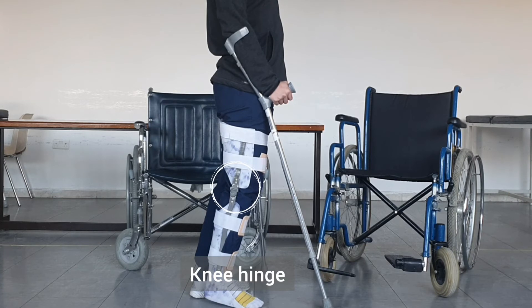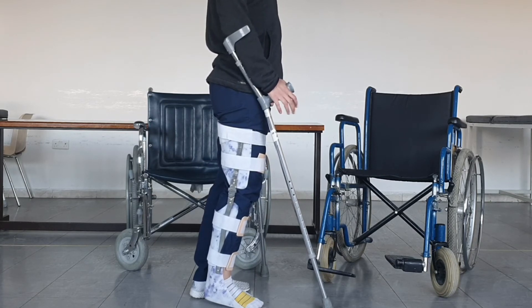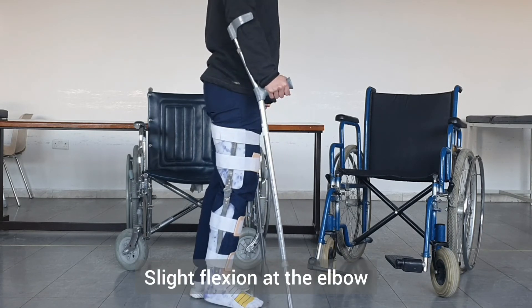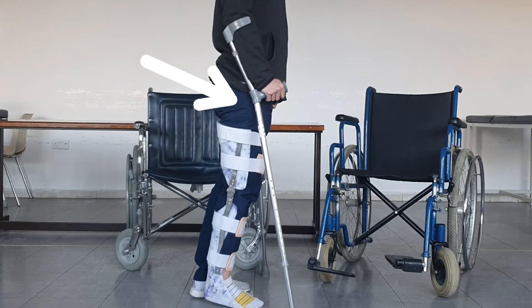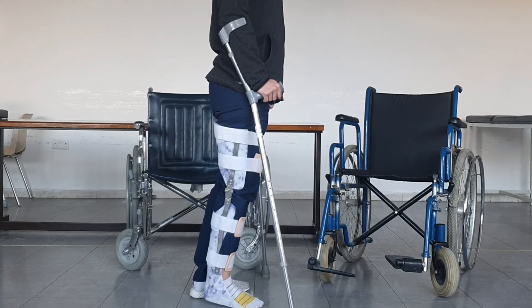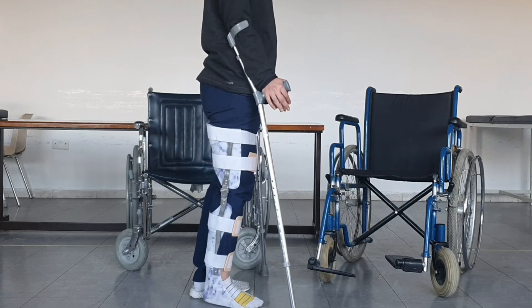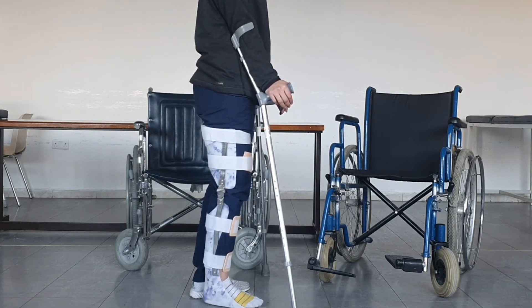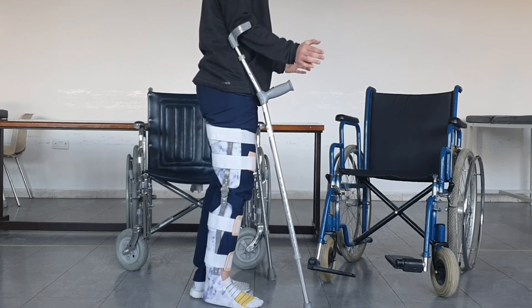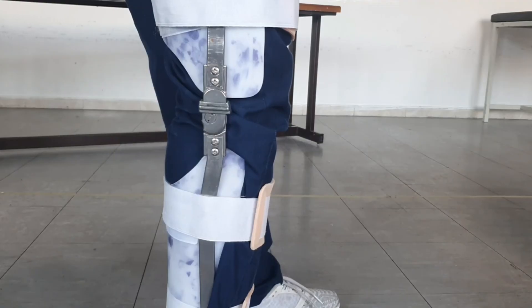The elbow crutches are adjusted so that when the patient is holding the handle there is slight flexion at the elbow, and it is at the level of the greater trochanter — just like fitting any crutch — and the elbow piece is slightly below the elbow. The advantage of elbow crutches is that the patient can release their hands while still keeping the crutch attached at the elbow, so they could do some light activity.